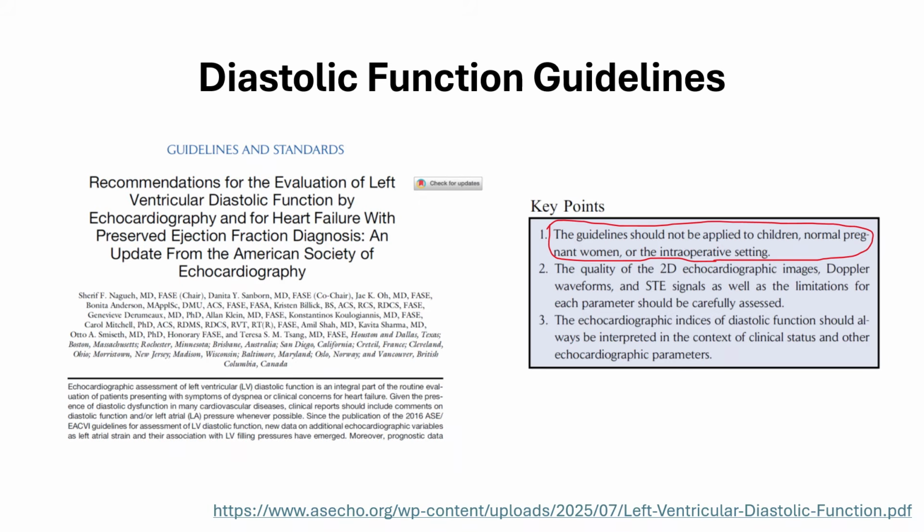Probably we should not be applying these guidelines to our intraoperative patients who we follow with TEE, but we can still utilize these guidelines when we are assessing the patients in the preoperative period of their care. I refer you to this wonderful document if you want to get more detailed or in-depth information about the LV diastole guidelines.